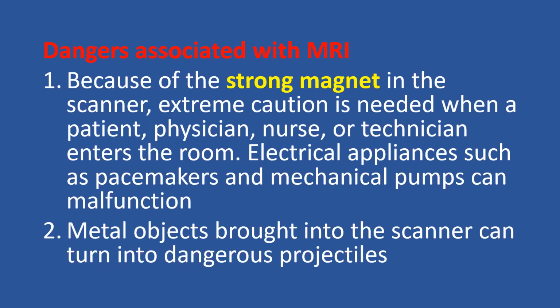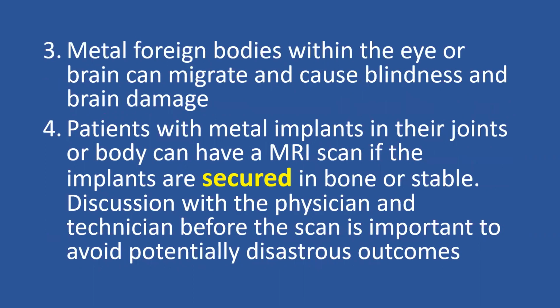Metal objects brought into the scanner can turn into dangerous projectiles. Metal foreign bodies within the eye or brain migrate and cause blindness and brain damage.